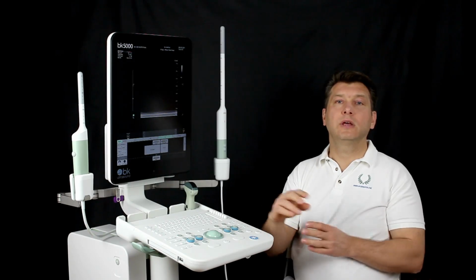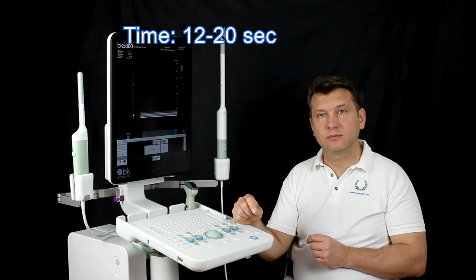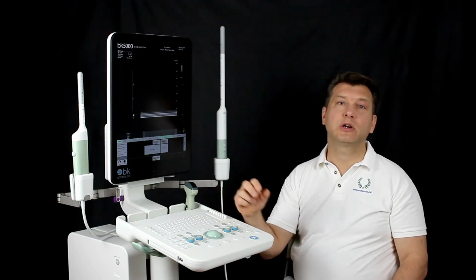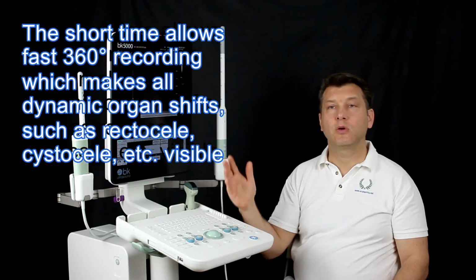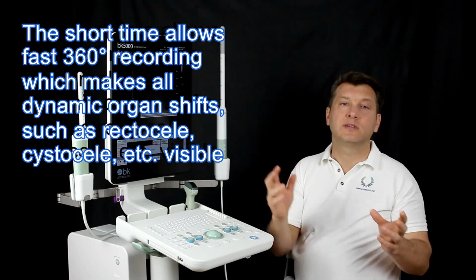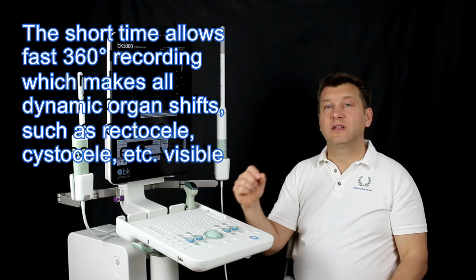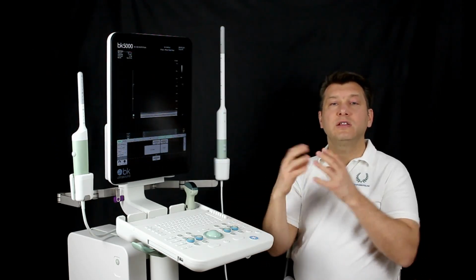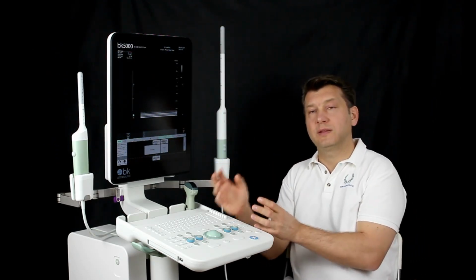Time 12 until 20 seconds. The short time allows quite fast 360 degree recording, which makes all dynamic organ shifts such as rectoceles, cystoceles, etc. visible. However, this is done at the expense of image quality, which decreases with increasing distance from the probe center.